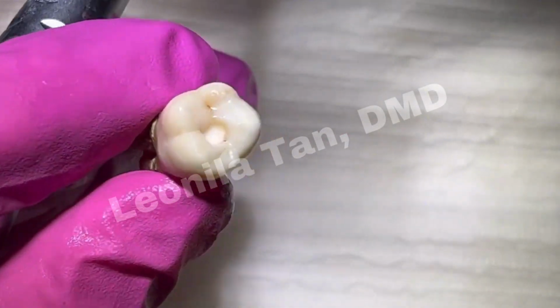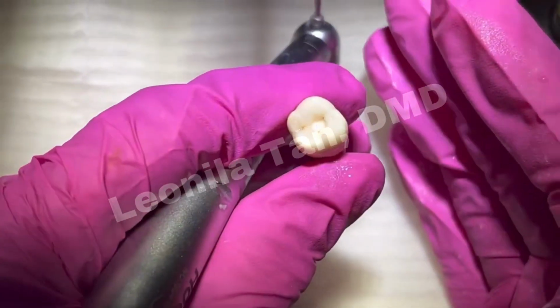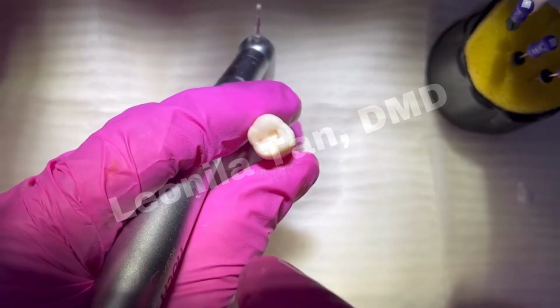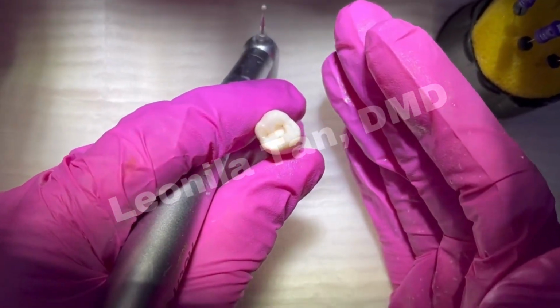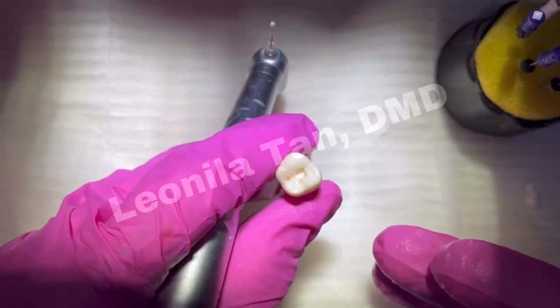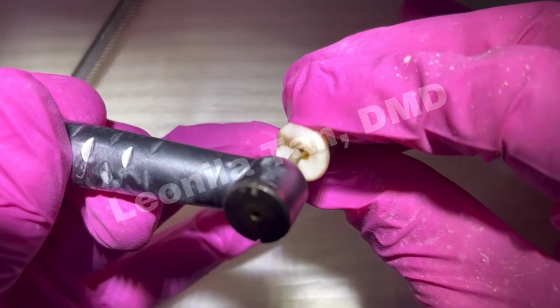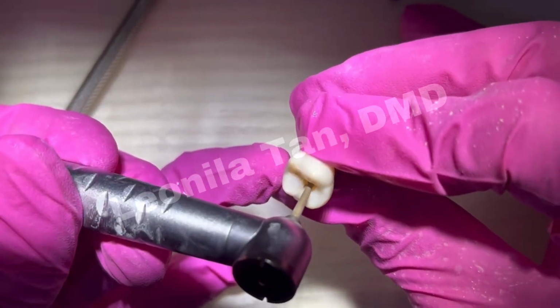But that's not yet done because now you have to flare. Okay, you have to open up the walls. After locating your orifices, now you want to open up, flare, or diverge the walls.